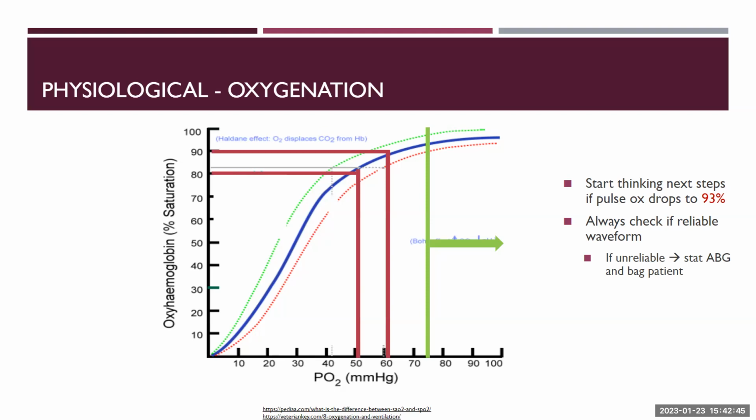I had one patient that had a long history of COPD, and we were really trying to get him off the vent so we could get him out of the ICU. It was more comfortable to have him at 95% or 94% instead of trying to push him up to 98%, because that just made him more reliant on the vent. So understanding the oxygenation curve doesn't go away when you get to clinicals.